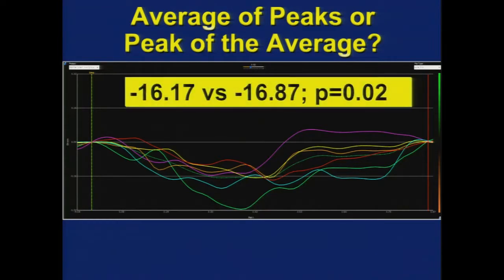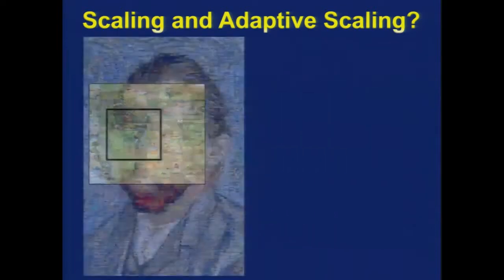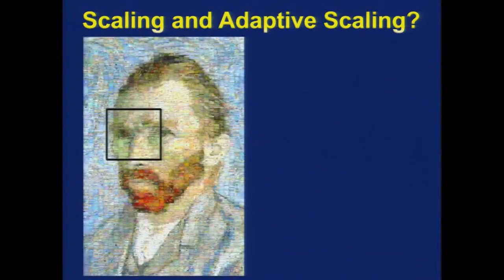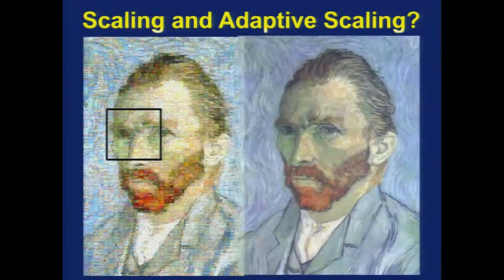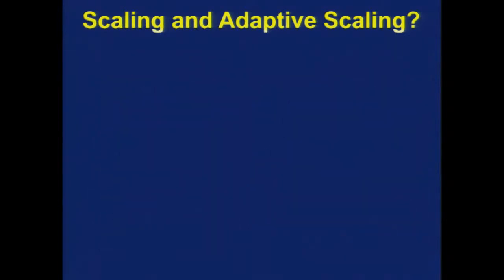Now the values, we said, were still a little bit different, even when we standardized the best we could. And the question of whether this is clinically important or not leads to this concept of scaling or adaptive scaling. The level of resolution is important. If you look at this very high resolution image, it's sort of a nonsensical image. It sort of looks like nothing. But at a lower level of resolution, that image makes very discrete and identifiable characteristics of this very unique face. Maybe this is the level of resolution we need. Maybe we need slightly higher levels of resolution, and of course, this is still left to some debate and question.